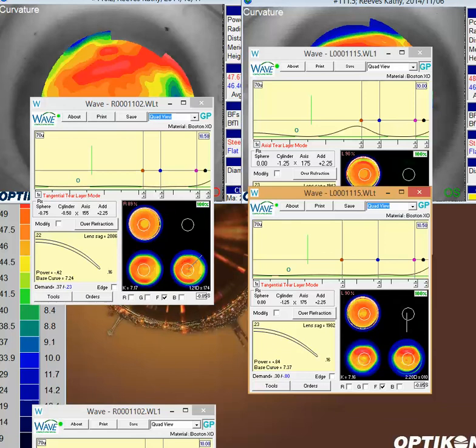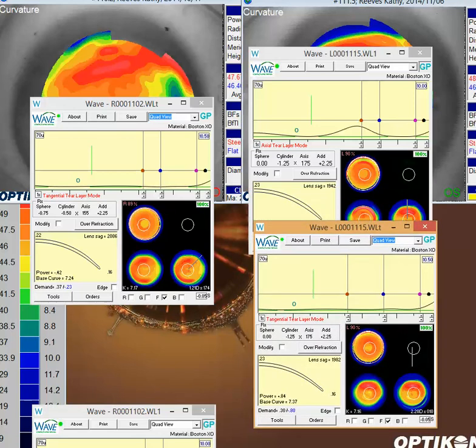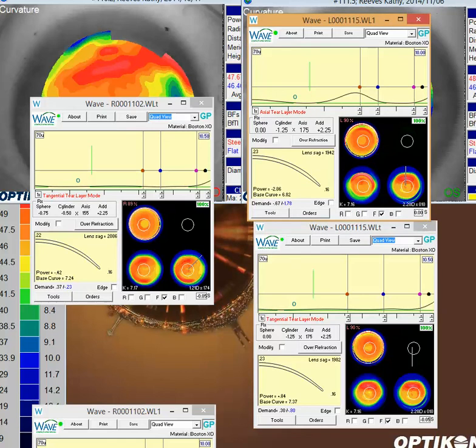But I would anticipate this lens would probably match the cornea a little bit more closely, or have a better chance of matching it than yours. And of course, keeping it larger will help that lens center more. So you want to keep it as large as you can get away with on these irregular corneas. By doing that, I think you should get a lens that centers better, that may clear up your weird over-refraction. Again, I think your over-refraction on the left eye is that the lens probably decenters, and you're probably picking up some needed minus over the add that the person's probably looking through.